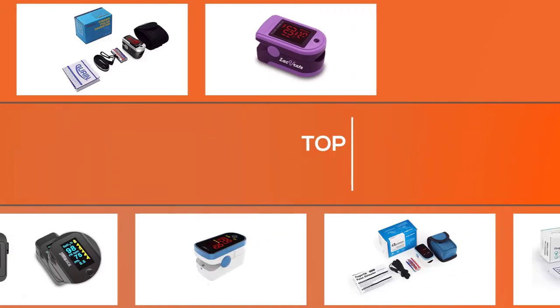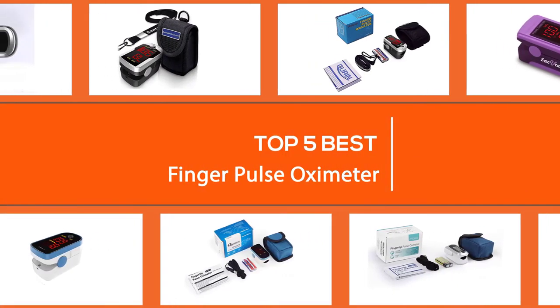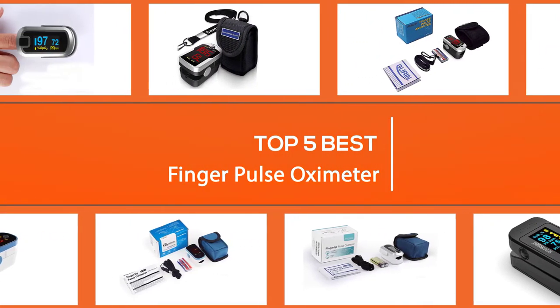A pulse oximeter is a device that is used to quickly and easily monitor a person's oxygen saturation. Here are the best pulse oximeters on the market today.